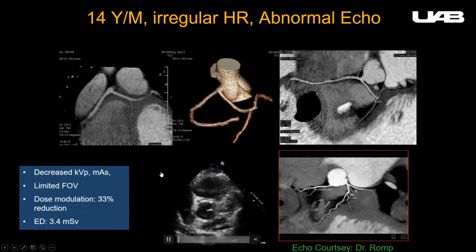Most intraseptal courses are not considered malignant. However, we do not have long-term data. Some people still operate on these cases, but they can be difficult, or at least watch carefully. And maybe these patients should not play exertive sports, etc.